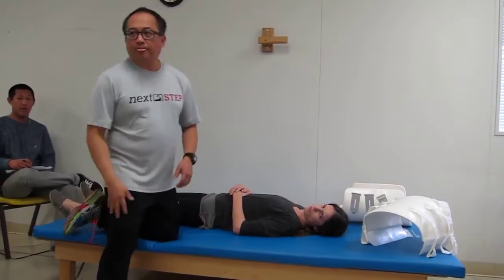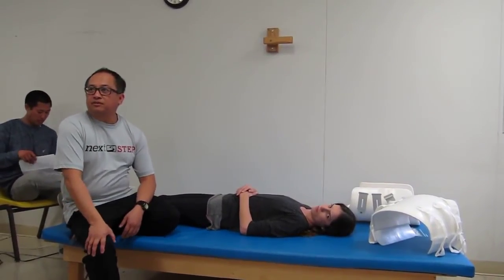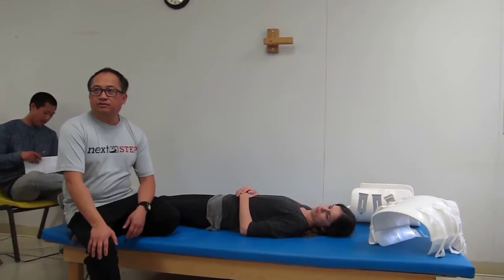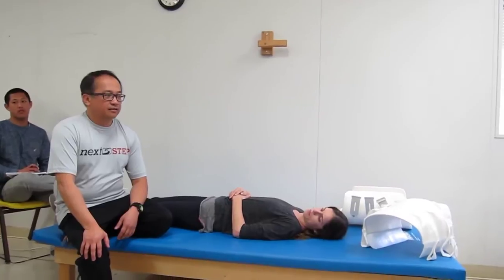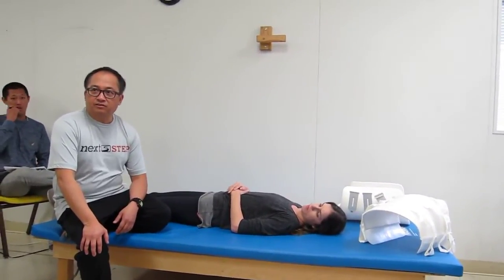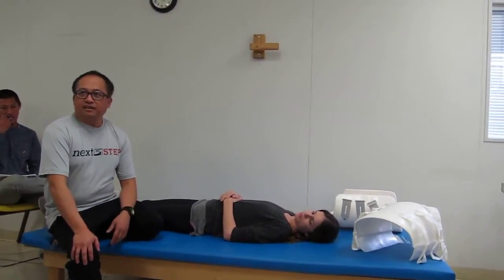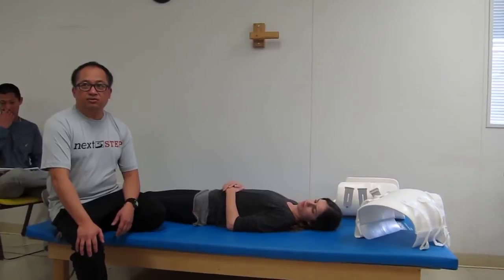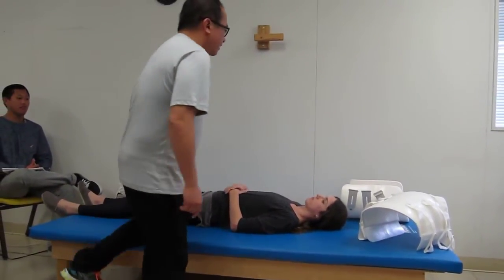Yes, Sam. Why would there be the difference for that? Can you give me an example? There's no example. It's just orthopedic surgeon's choice. Mechanically, typically the spine is stable at that point, based on the surgery that they had. So it is really the MD's choice. Okay.